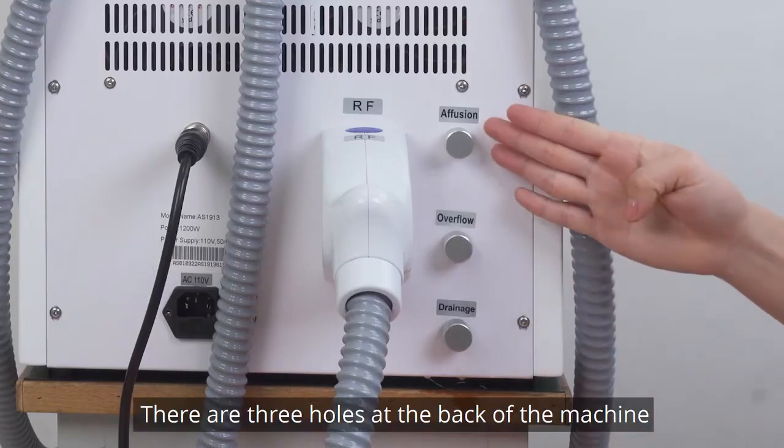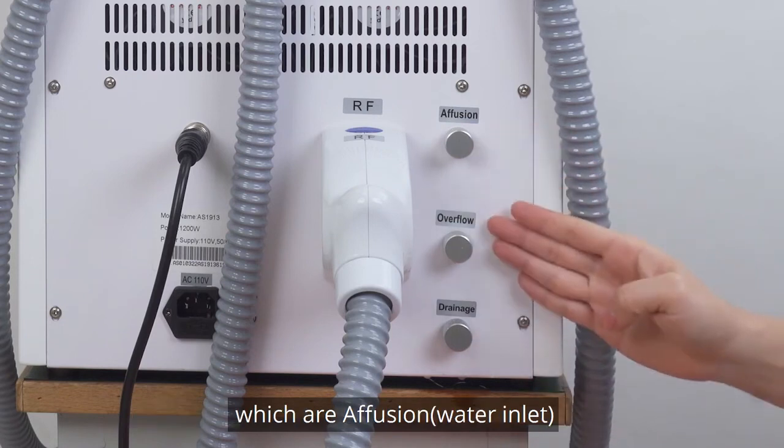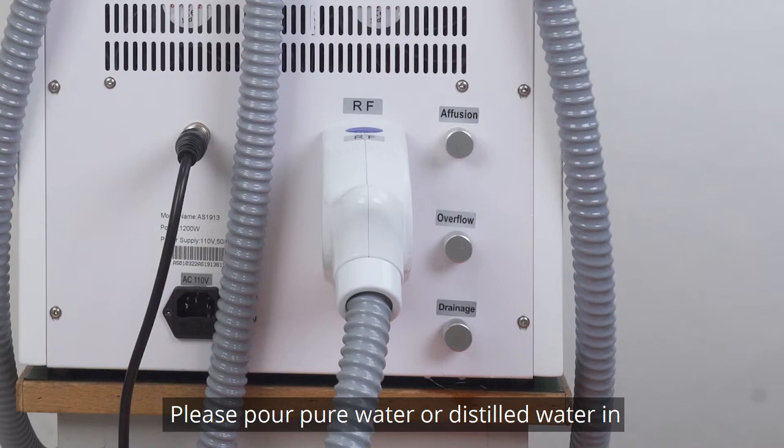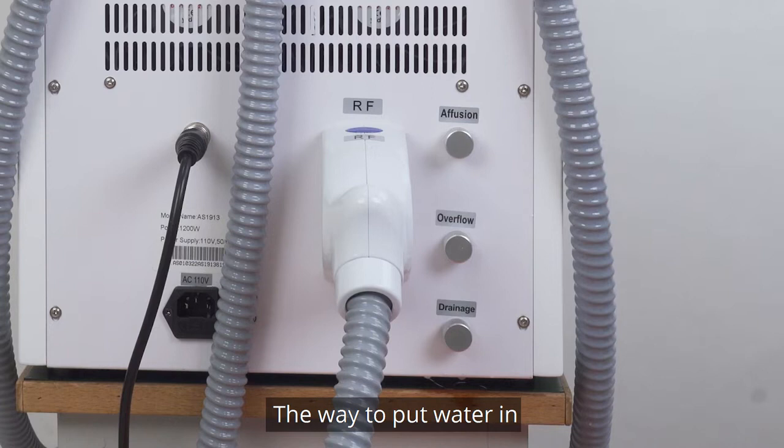There are three holes at the back of the machine which are infusion, overflow, and drainage respectively. Please pour pure water or distilled water in before starting the machine.